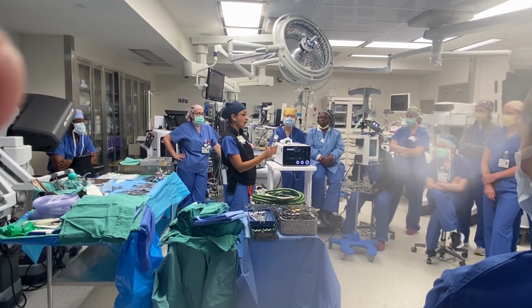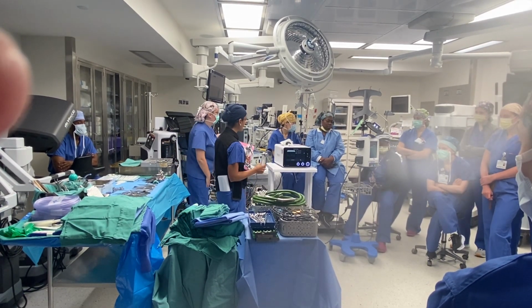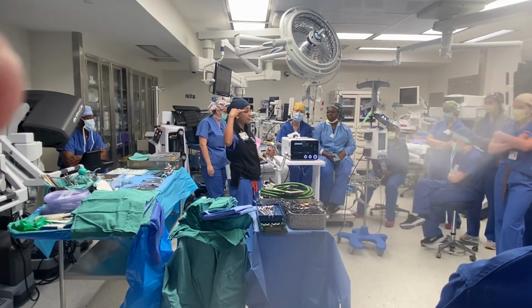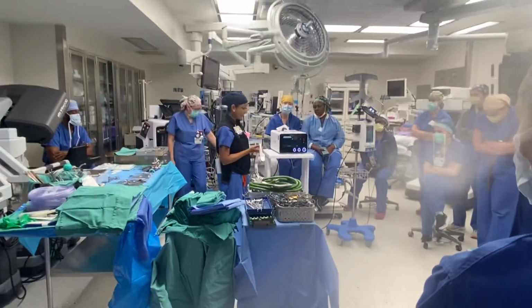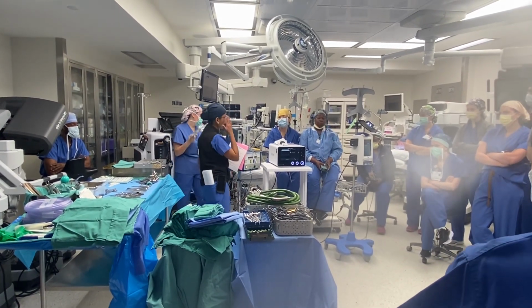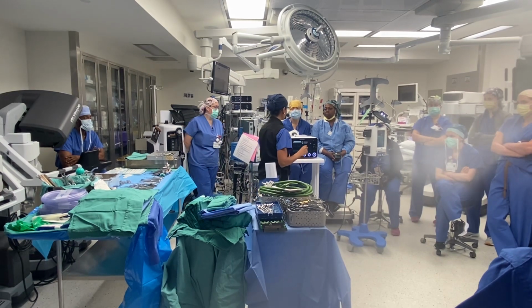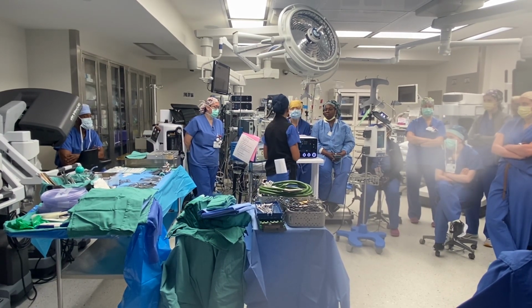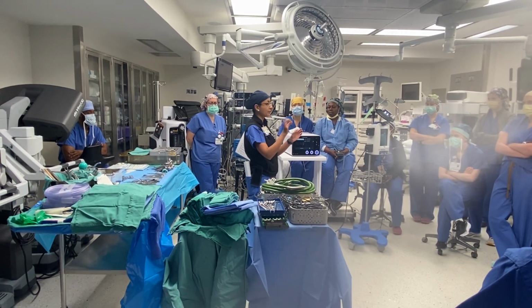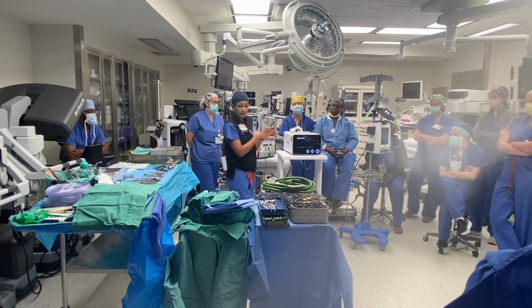I won't go through this too much, but these are attached to the bed with another connector, and you'll see us pin the patient, about 60 to 80 pounds of pressure in the head. That will keep the head stable, so when we're drilling and doing all of our work, the head's not moving. Occasionally, when we are using the Mayfield for an intradural or inside-the-brain case, we will also connect a Stealth setup. That will allow us to navigate where we're taking out a tumor, for example. So back to that emergency case.